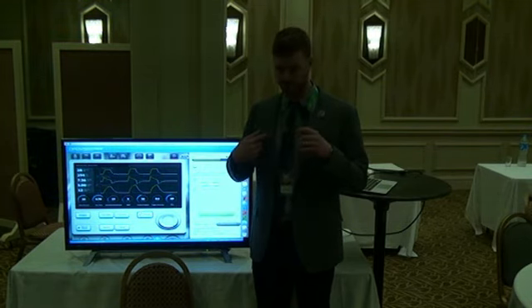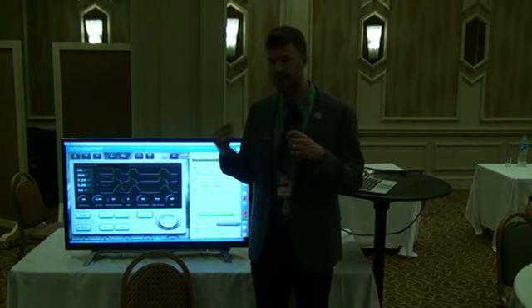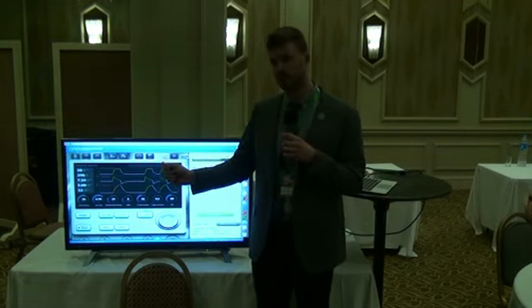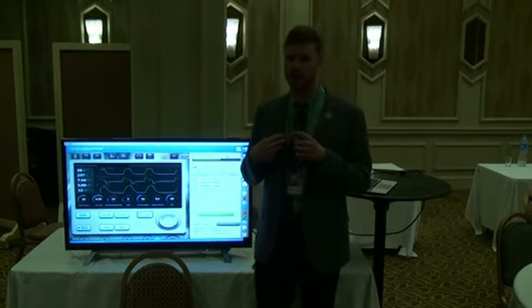Typically we'll have mainly two sites, and I believe it's every 12 hours that we'll do that, and we recalibrate and take everything off every 24 hours to make sure that we recalibrate it in the dock of the device. Don't quote me on that. I guess I'm on camera now saying that, but I think that's our practice.